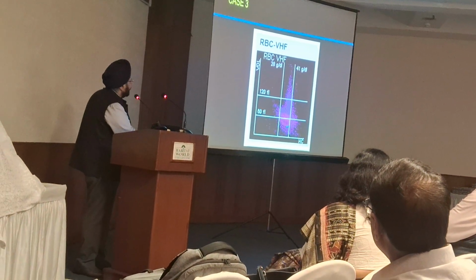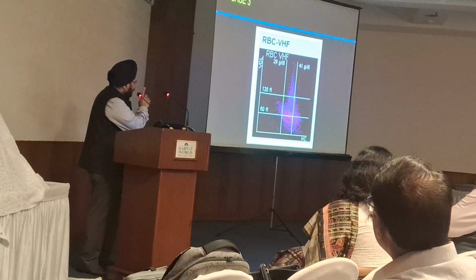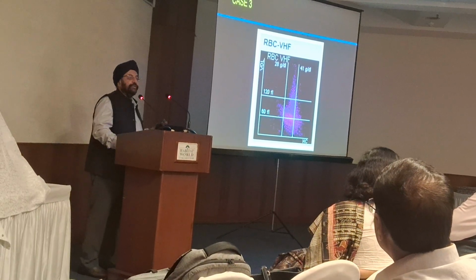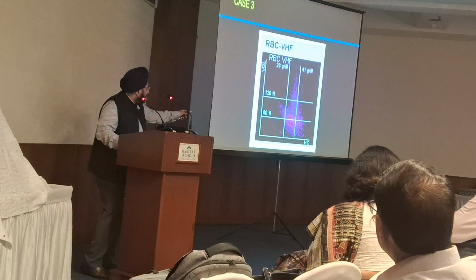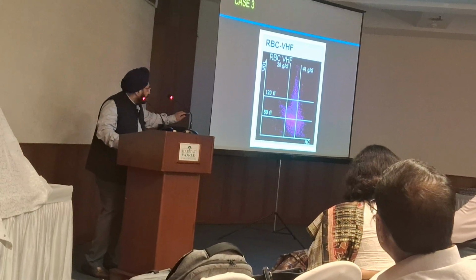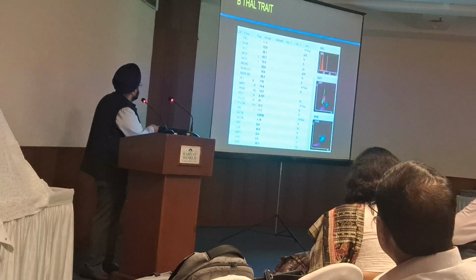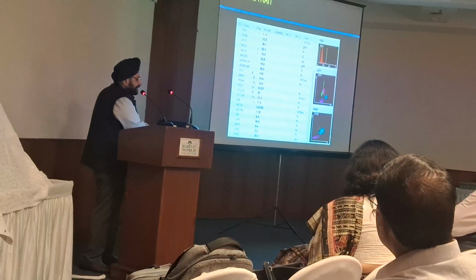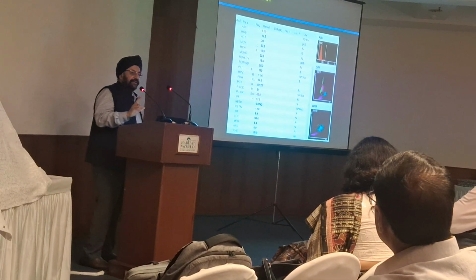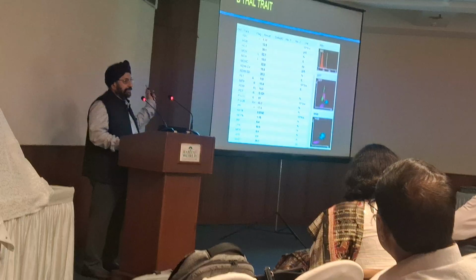Look at this graph in contrast to the previous one. There is only microcytosis. There is no hypochromia. So beta-thal trait will always have only microcytosis. There will be no hypochromia. This is a case of beta-thal trait, just on the scatter plot; I have not seen the indices. Hemoglobin 12.5, you look at the Mentzer index, it's 10. RDW is normal, it is given away. The only problem will occur when there is both IDA and beta-thal together. Then it will look like the previous graph of IDA.